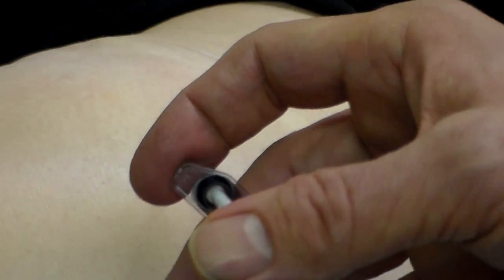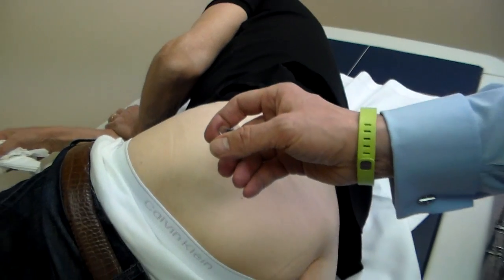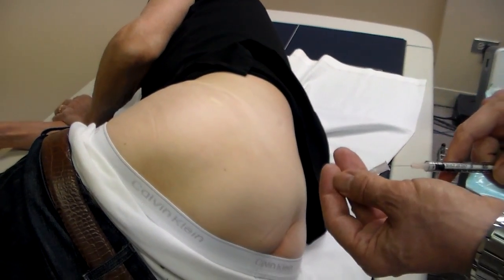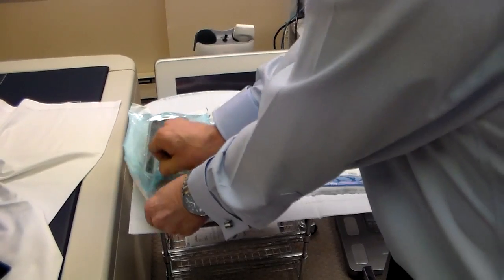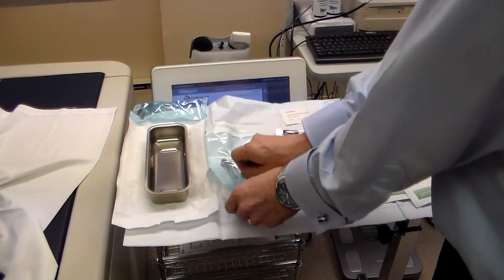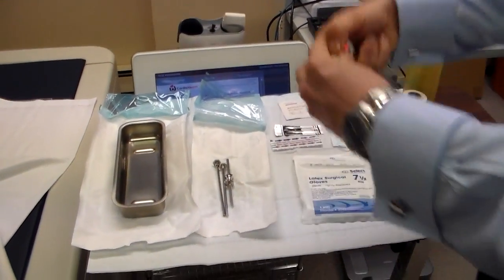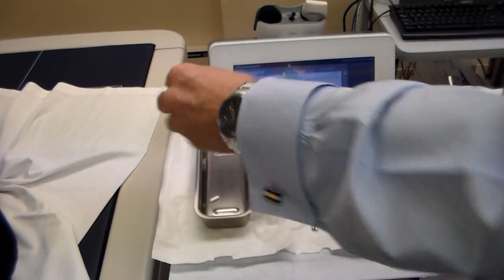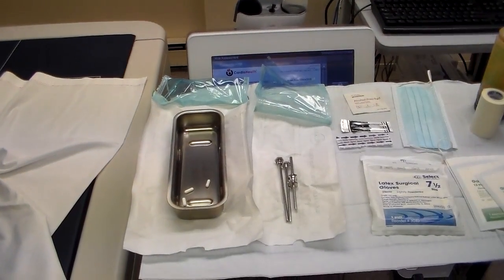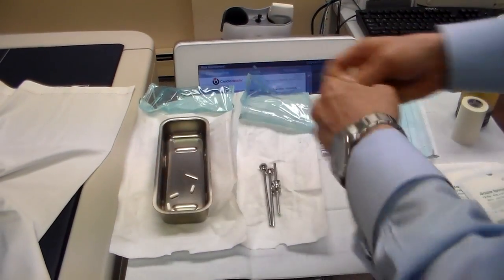We will be inserting the pellet in this direction, going at an angle of about 30 to 45 degrees from the base of the skin, and we'll let that numb up for a few moments. We open the sterile container with the sterile tray and trocar set, take the testosterone pellets and put them into the sterile tray, then take the 11 blade and place that in the sterile tray as well.